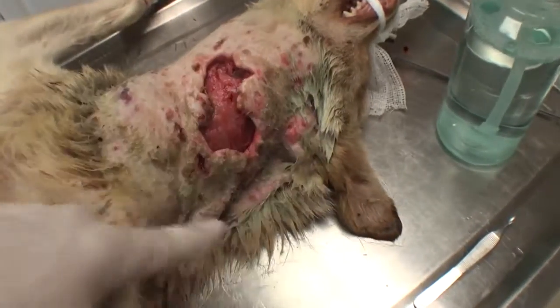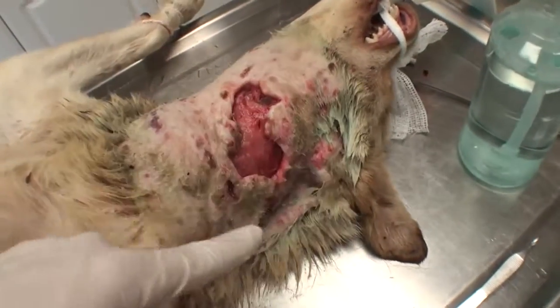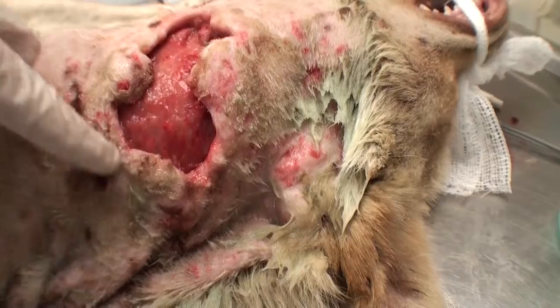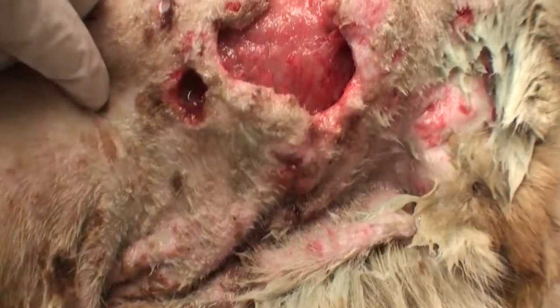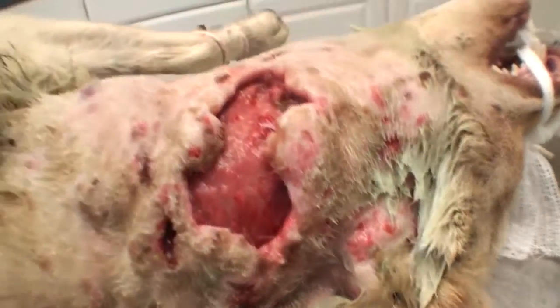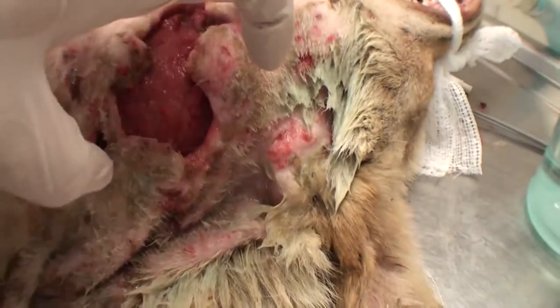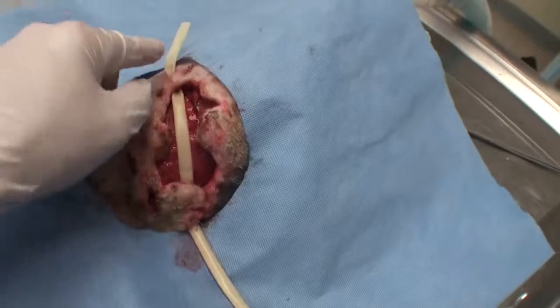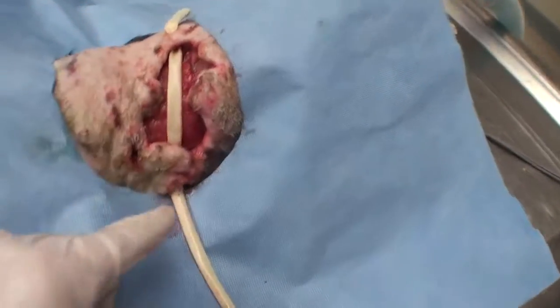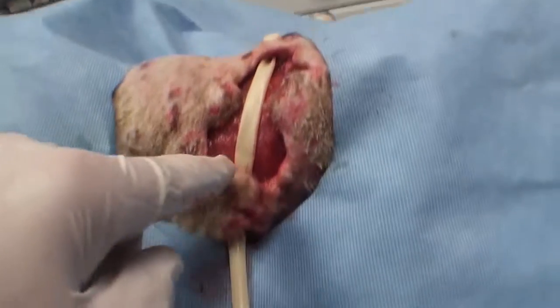All right, I've scrubbed all of the tissue around this. I flushed out the inside of this wound. I'm gonna cut fresh edges on all the edges down here. Nice hole right there. And then I'm gonna put a drain tube in here so that this thing can drain and that pus will have somewhere to go besides just building up underneath those sutures. I have the drain coming out of a hole just on this side of the laceration and one coming out of a hole just on this side of the laceration.